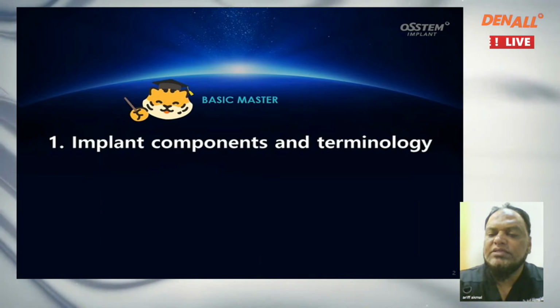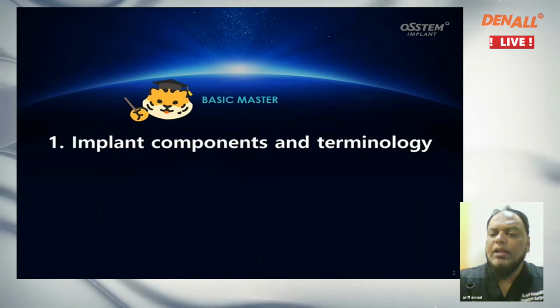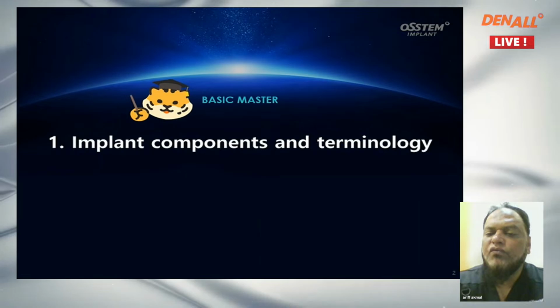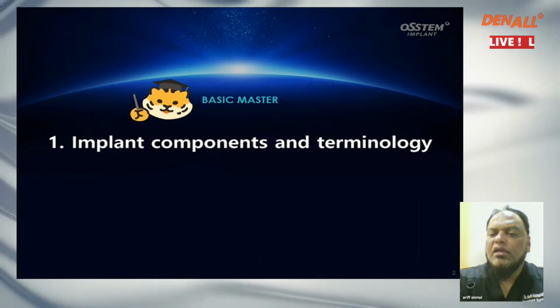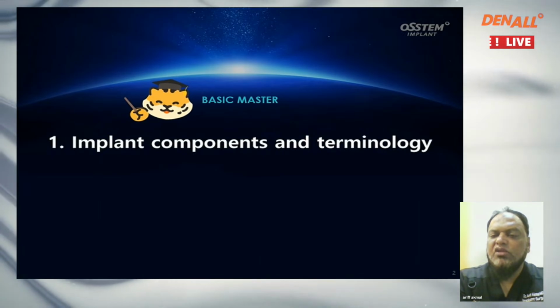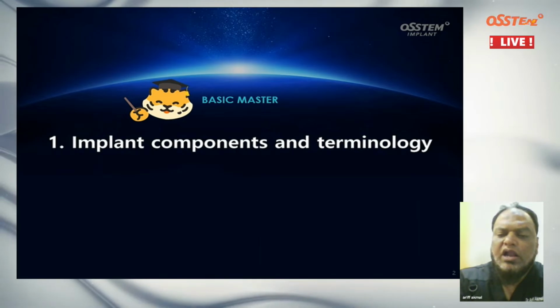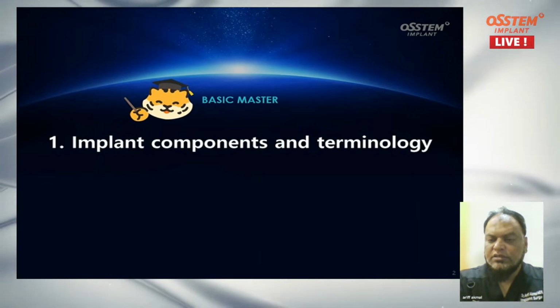So once you start placing the implants in the simplest of the cases, start with single implant case, then go on to multiple, and then you can go in for full mouth or full arch rehabilitation. If you are well experienced enough and you have placed a lot of implants, then you can go for extra max implants, sinus graft, all advanced techniques, which I'll be briefing as the day progresses.